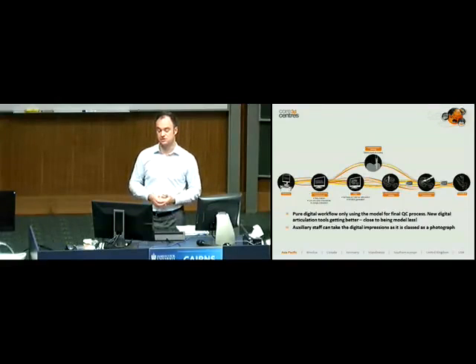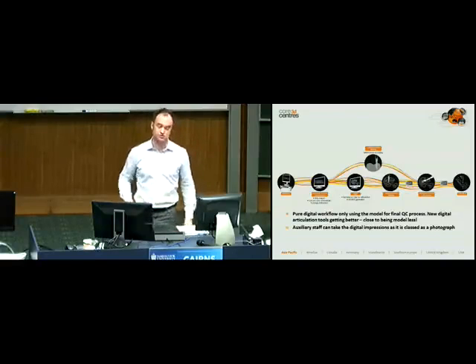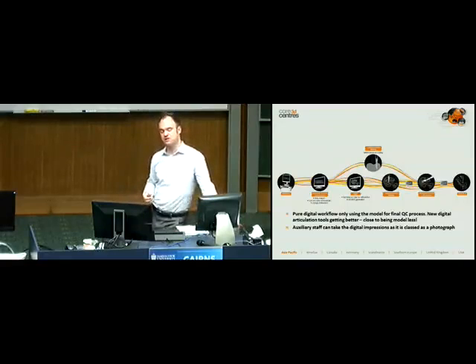The lab then just works on the model as they ordinarily would with the milled restoration, and then they send it to you and it fits into the patient. These things fit extremely well because you've recorded the occlusion yourself. They fit much better. Labs don't have to hedge their bets, if you like, by having slightly heavy contacts because they know how accurate these models are. So you'll find that your seating appointment is much faster, and as I said, most people don't even try in. A lot of people are just cementing them straight in. They just know they're going to fit, and that's incredible to have that consistency, and that's what it's bringing to your practice.